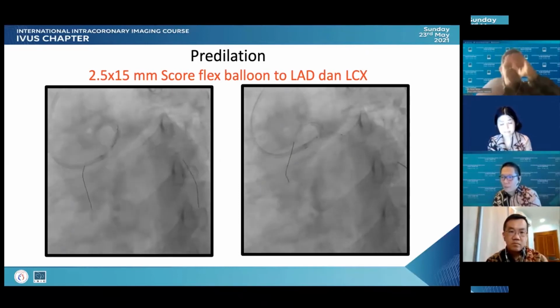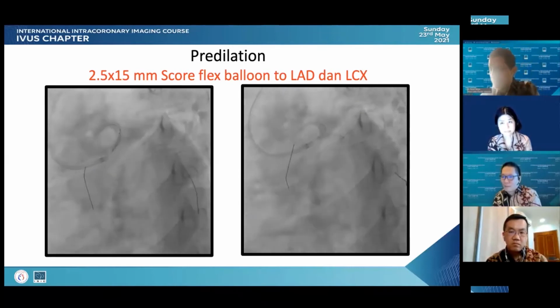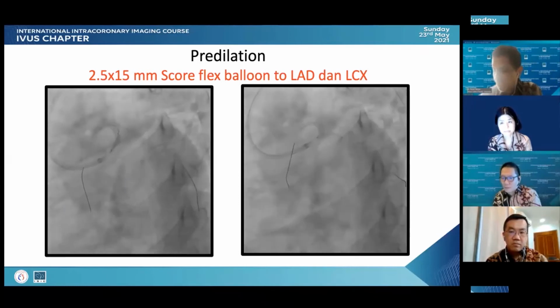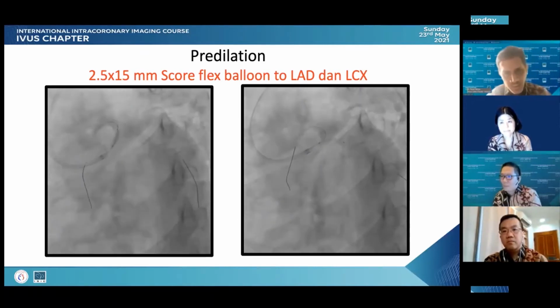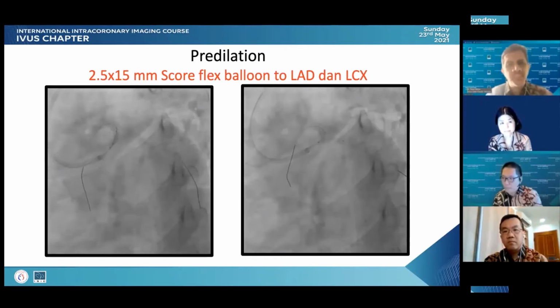Even in the PREPARE-CALC study, a large percentage of the patients who had rotational atherectomy actually had post-dilatation with Scoreflex or scoring balloons, or cutting balloons, afterward. I think it was up to nearly 30%, if I remember correctly.